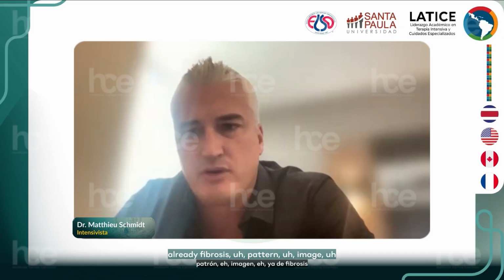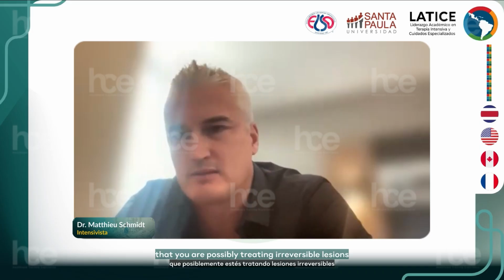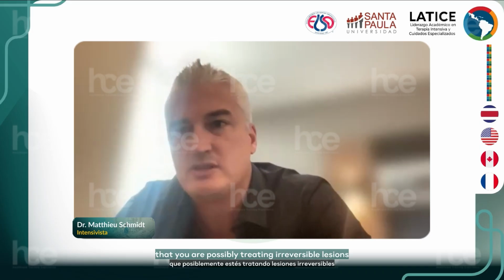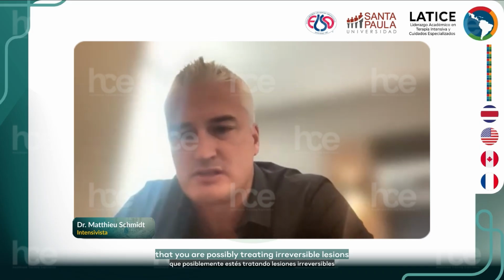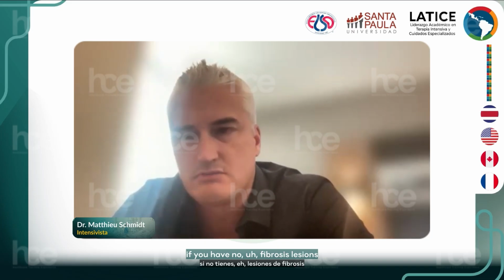Is there already a fibrosis pattern on imaging that may indicate that you are possibly treating irreversible lesions? On the other hand, if you have no fibrosis lesions, we will probably cannulate the patient, even if the patient has been ventilated for 15 days or even longer.